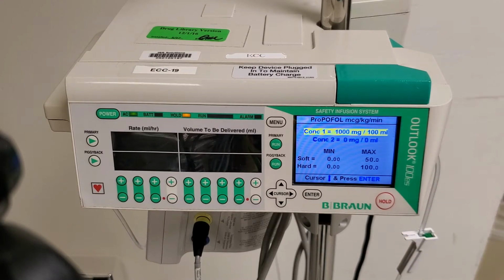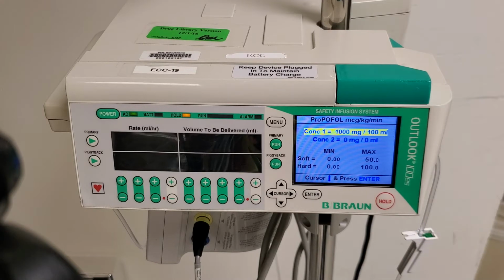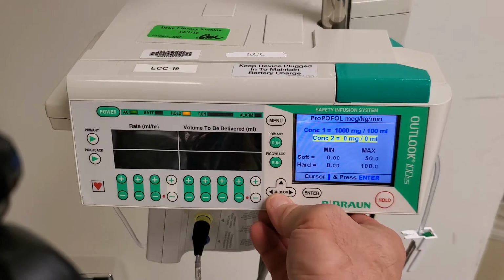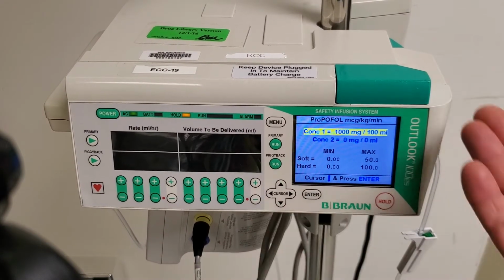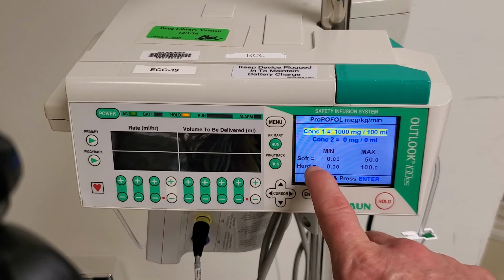Now we have to set the parameters for the pump, starting with the concentration of the drug. There are two choices here. The standard, which is 1,000 milligrams and 100 mLs, or some other concentration. If we select concentration 2, the next screen will have us put in whatever the concentration is, 500 milligrams in 100 mLs.